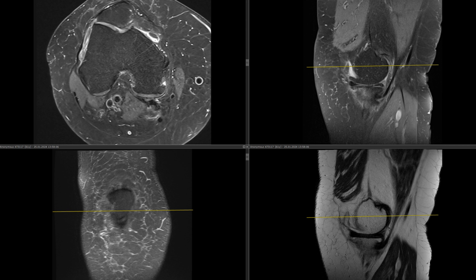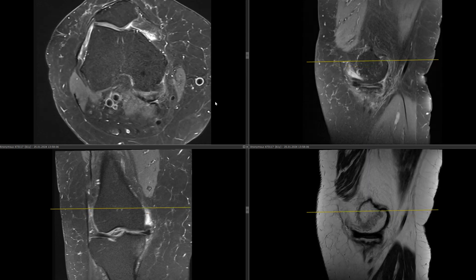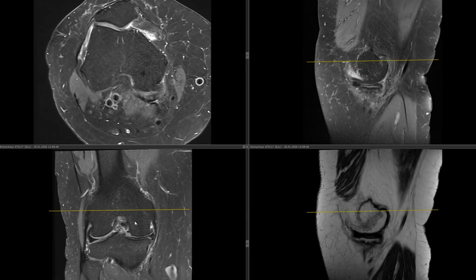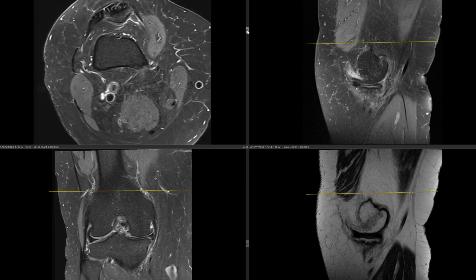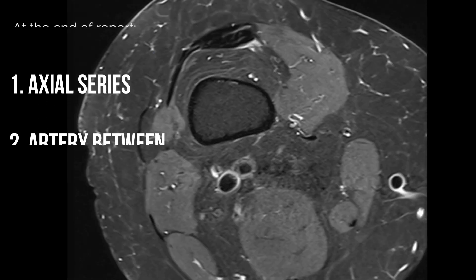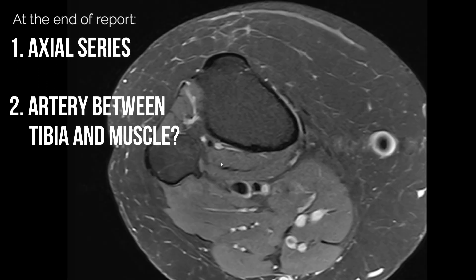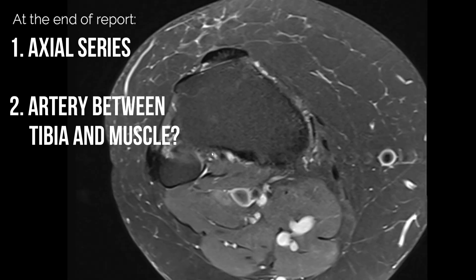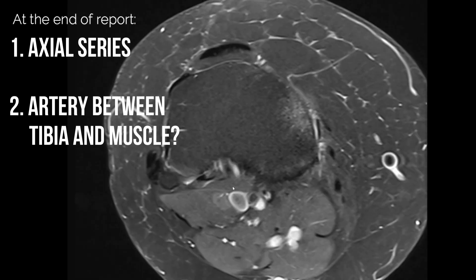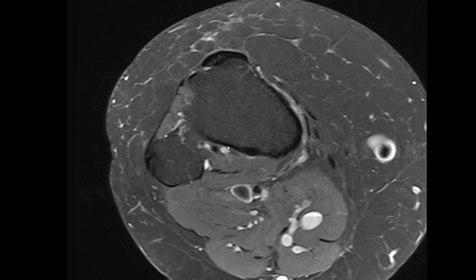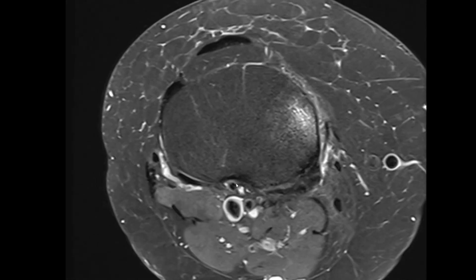The last thing I want to show you is an easy trick so you never miss this variant again. Assume you're reporting a knee MRI using the standard template — medial, lateral, central, patellofemoral. The very last step before closing the study: open the axials, scroll through once, and just check the danger zone behind the proximal tibia for a vessel. If there is a vessel, report it. If there is no vessel, say nothing. This takes about two seconds, and that way you will never miss this variant again.